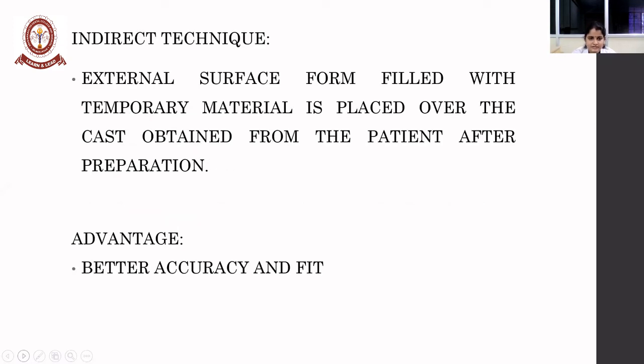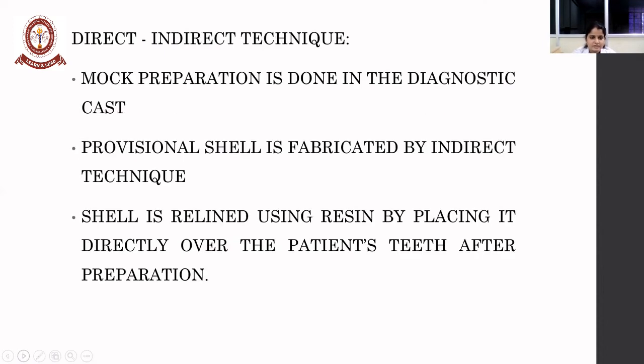Next, the indirect technique is an external surface form filled with the temporary material, which is placed over the cast obtained from the patient after the preparation. I have already shown this in the video and explained it. The advantages of this technique are better accuracy and fit.